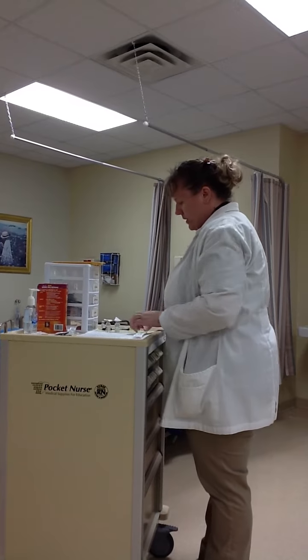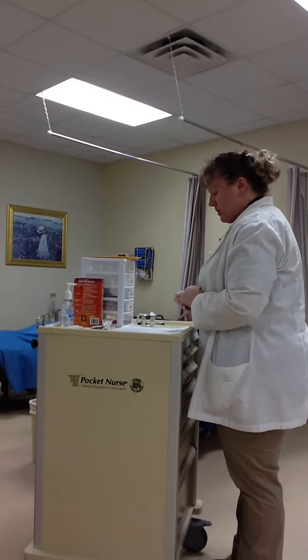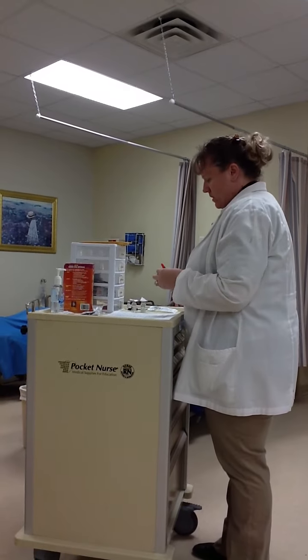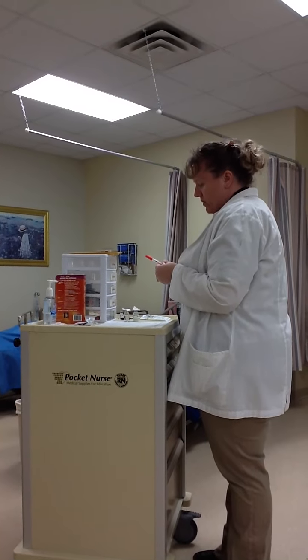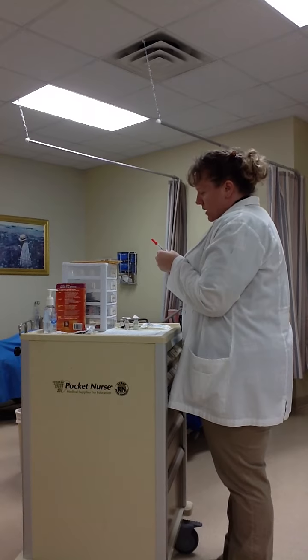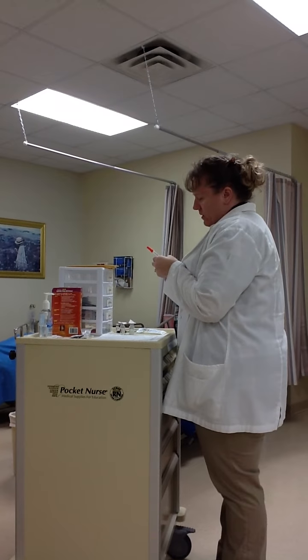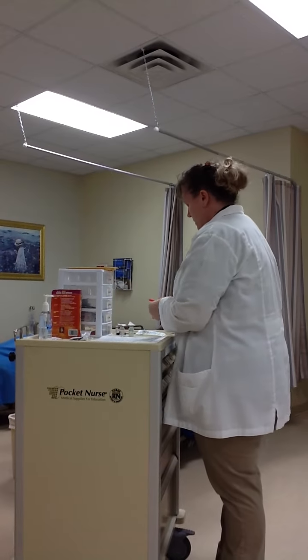And I have both of those ready. I note that I'm going to mix them, so I always go from clear to cloudy. So in going clear to cloudy, I want to put air in the cloudy first. And I know that I have 24 units of NPH, so I'm going to put in 24 units. And I'm going to show that to my instructor before I do it.